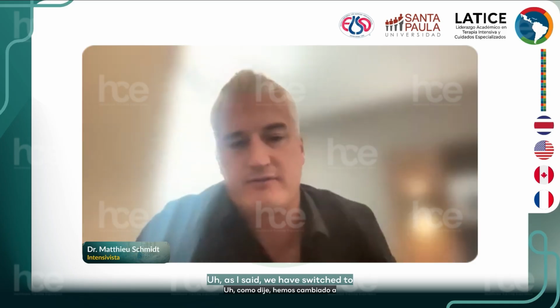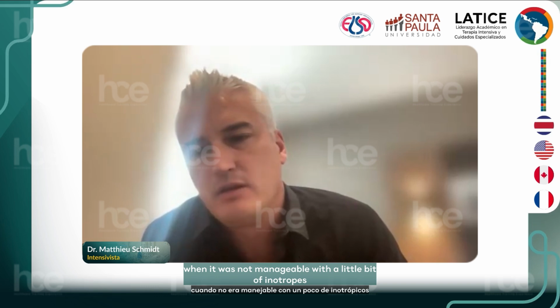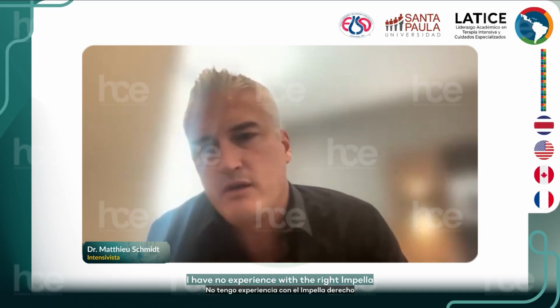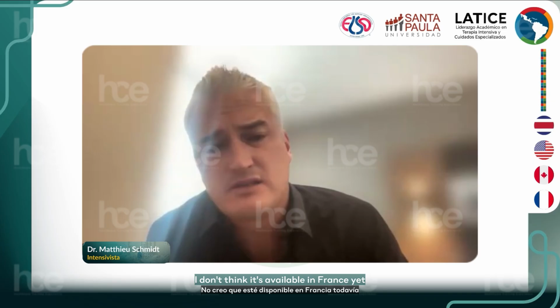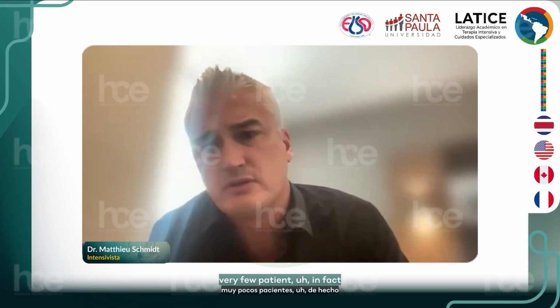As I said, we have switched to a venopulmonary cannula a couple of times, but only for patients when it was not manageable with a little bit of inotropes. It's always challenging to change the configuration. I have no experience with right Impella. I don't think it's available in France yet. But it concerns very, very few patients, in fact.